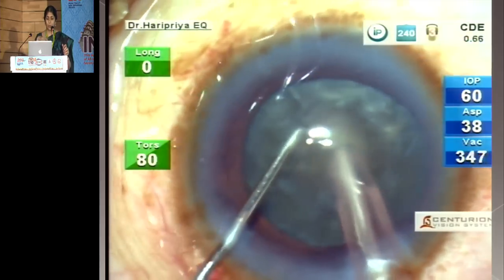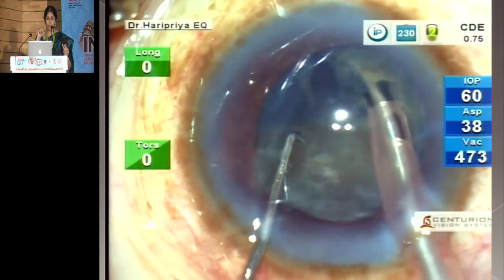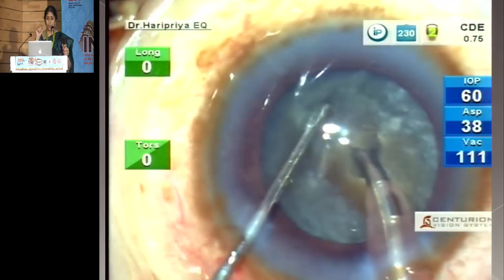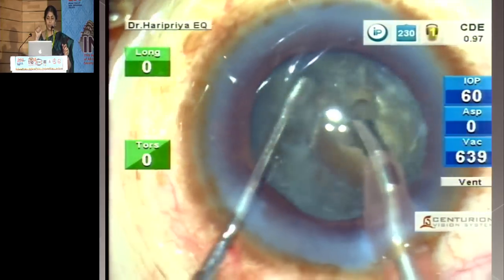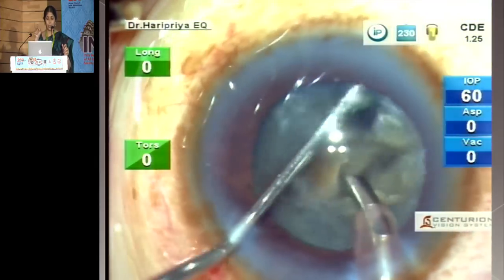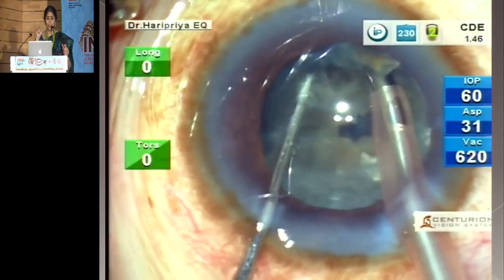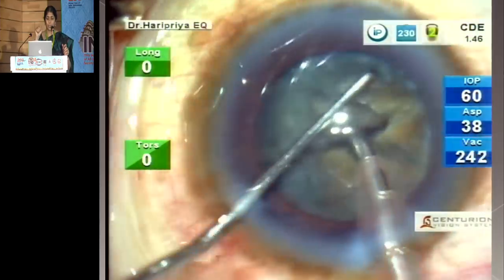For the phaco chop technique, a small burrow is made, and then the chopper is placed in front and the nucleus is separated. I would like to have more of the tip exposed here. You can see how well you can actually hold. This holdability comes when you have good cutting; you will also be able to hold deeper and hold firm. So use the vacuum appropriately to hold on to this nucleus, and then use your chopper to separate it.